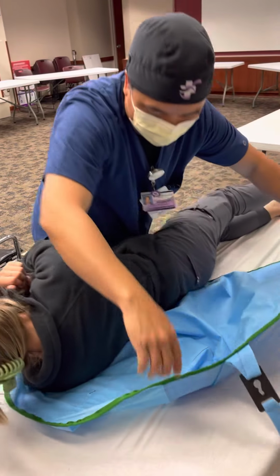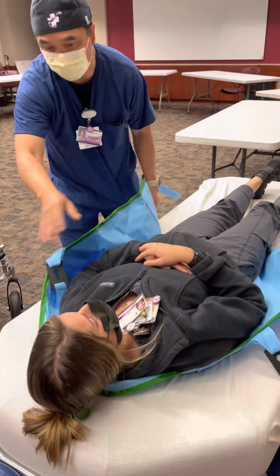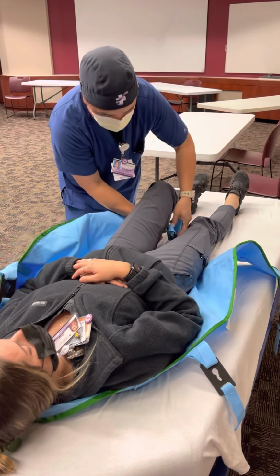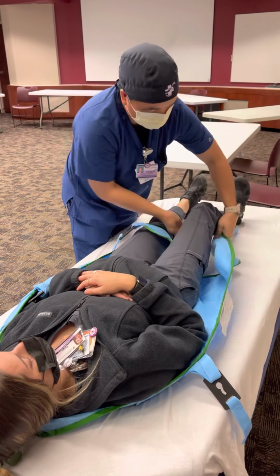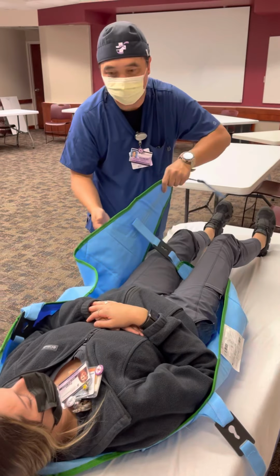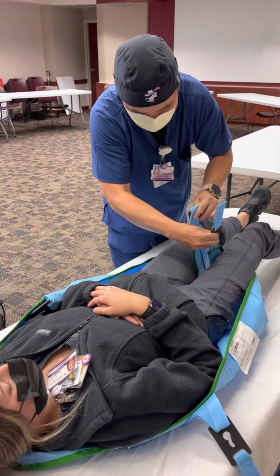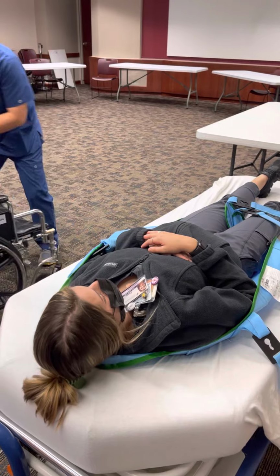And roll back. All right, so you try to get it in the middle as much as possible. And the main thing you need to remember is this strap, this area right here should cradle the thighs. Okay, and this one too. Because if you put it outside, most likely when you raise, the patient will just slide out of the sling. Right there.